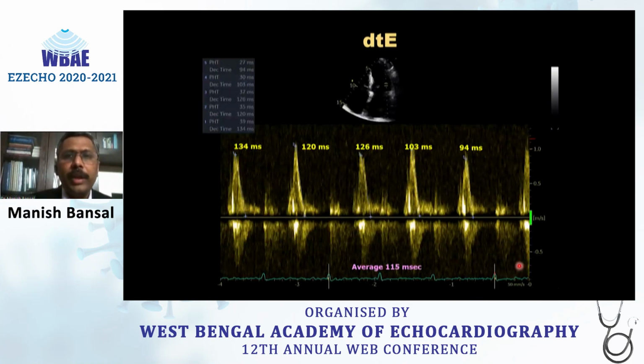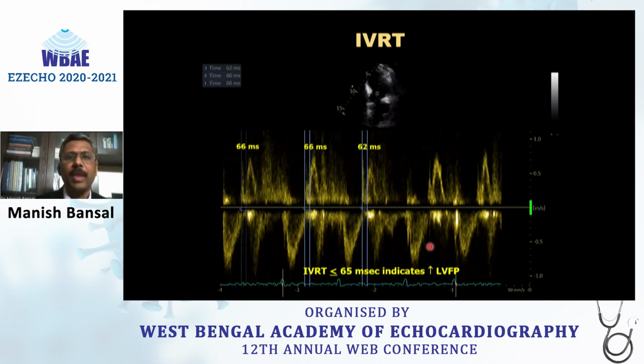Then we can look at DT, deceleration time of E wave. This is applicable mainly when LVEF is reduced, but in our patient who had preserved EF, DTE was markedly reduced, 115 milliseconds, indicating elevated filling pressure.